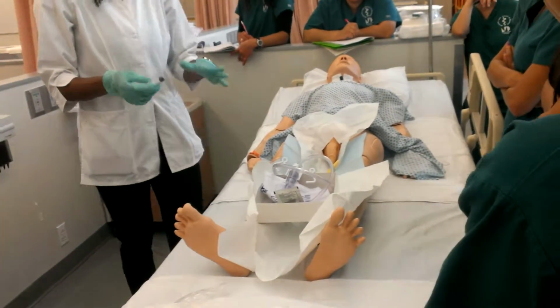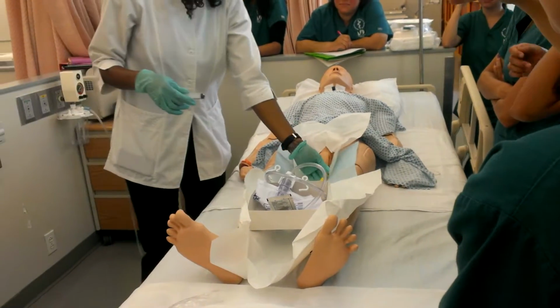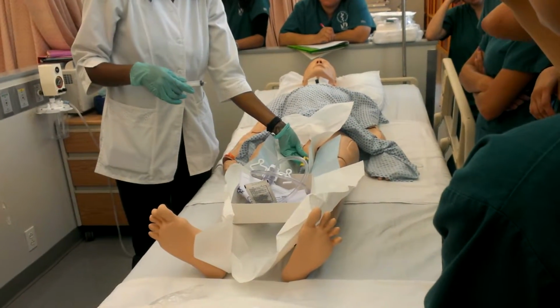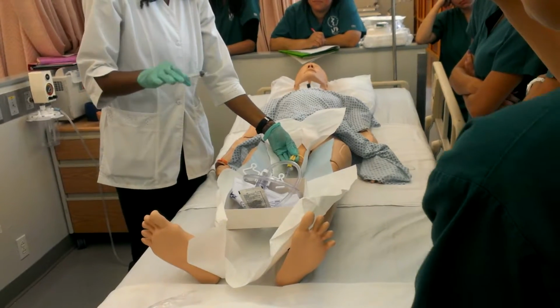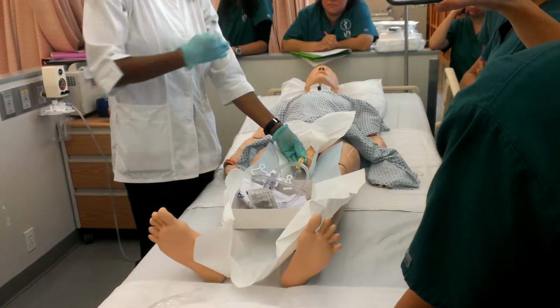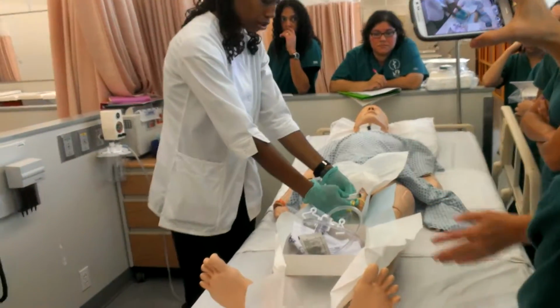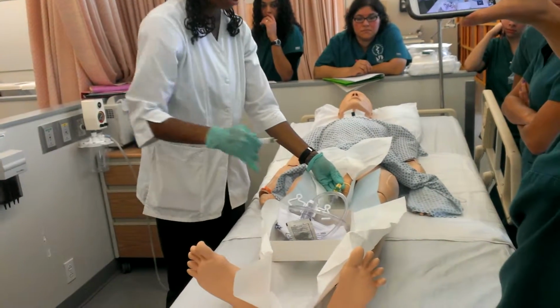And that is it. So the difference is just that you do it over the thighs. And then you have to go all the way in before you stop. And you'll see urine before, it doesn't matter. You keep going, because you want to make sure you make it past the prostate into the actual bladder. So you'll see urine through the tube or just coming out? Through the tube, yeah. You'll see it just start flowing out.